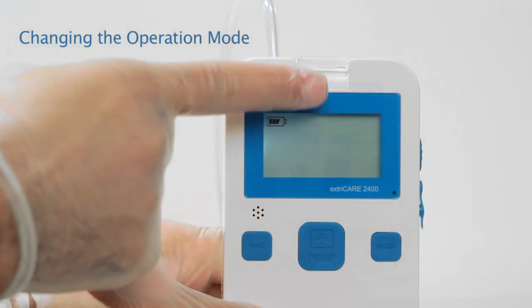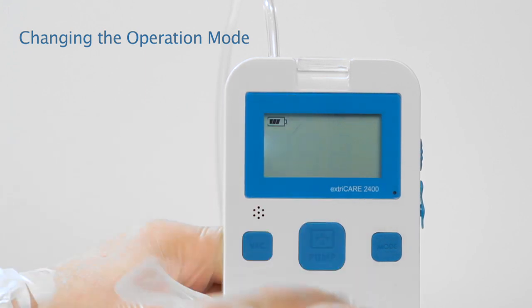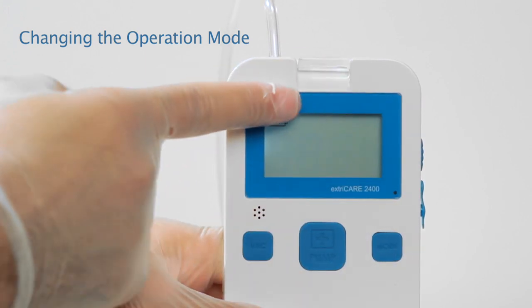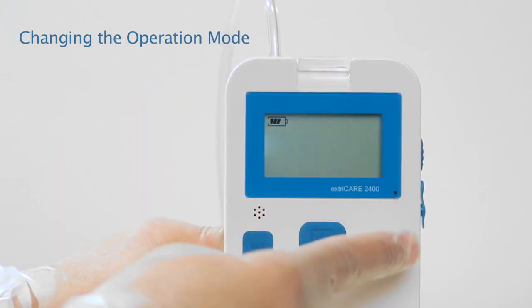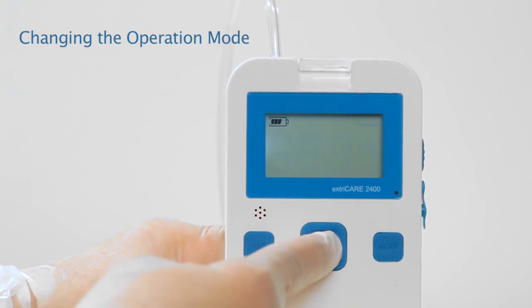In the top right corner of the screen, you'll see a straight line indicating continuous mode or a dotted line indicating intermittent mode. Once the desired mode is selected, press the PUMP button to confirm.